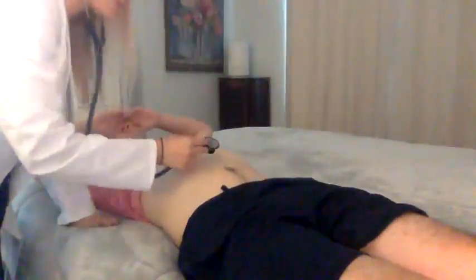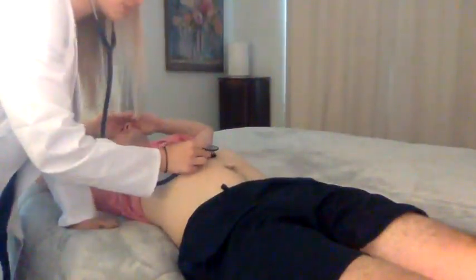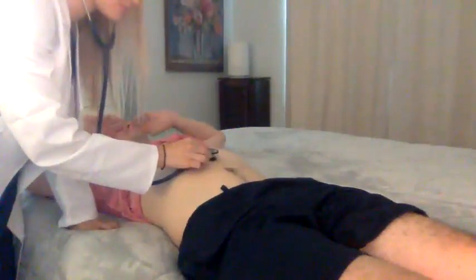Now I will be auscultating for any kind of bruit that I hear in the abdominal area, and I will use the bell of my stethoscope to do this. I will start at the aortic area, which is midline and right below the xiphoid process.